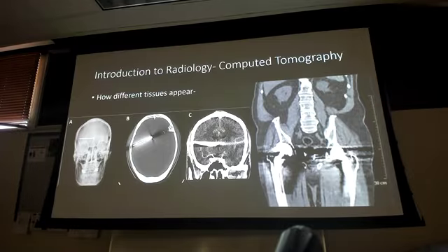Same thing here. X-ray shows me he's got a nail in his skull. I don't know where. I don't know what direction. I don't know how bad the damage is. So we're going to get a CT.